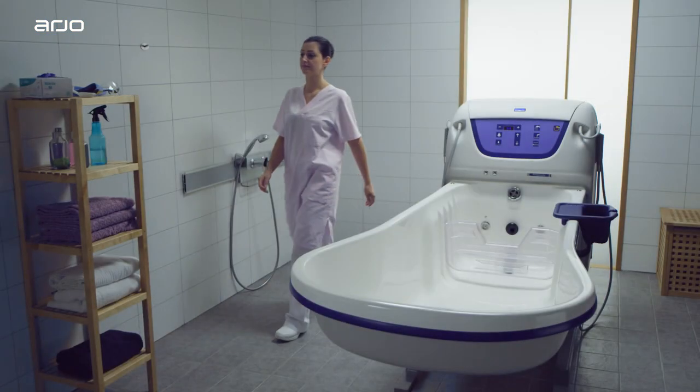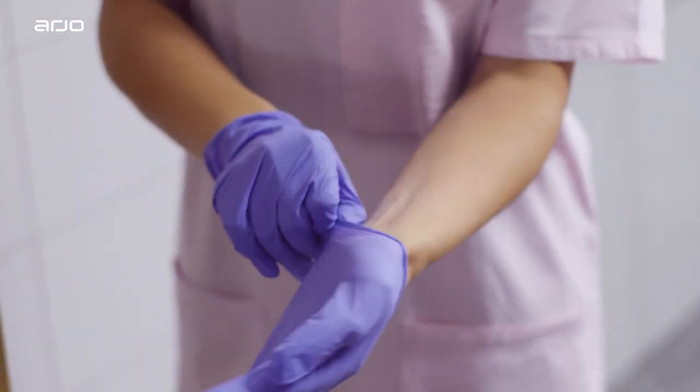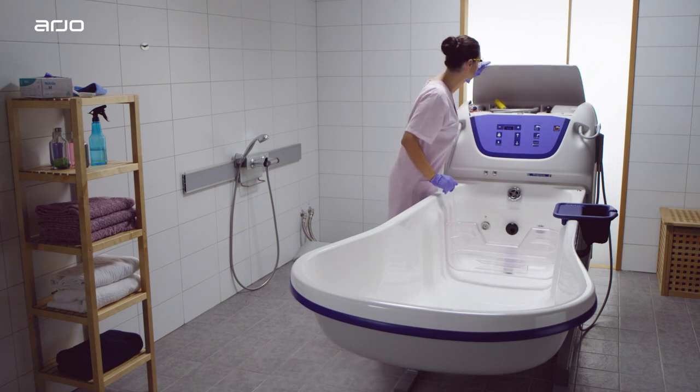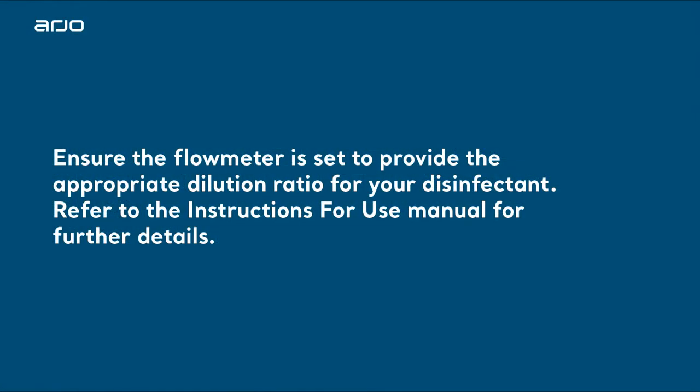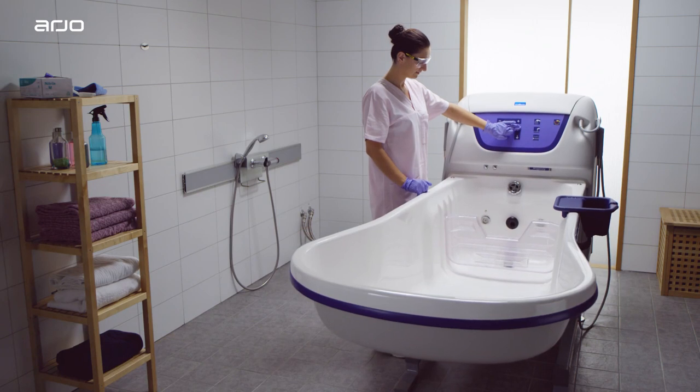When cleaning the Rhapsody bath system, begin by applying safety glasses and gloves. Open the service compartment on the bath and check the disinfectant level. You may then adjust the bath to a comfortable ergonomic height that is most comfortable for you.